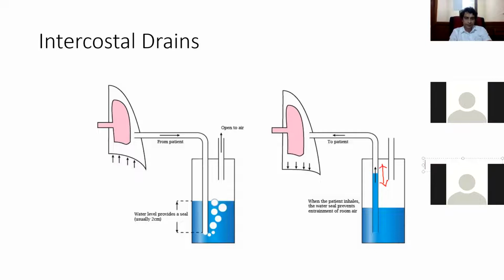That is called the swinging of the intercostal tube. So whenever you have an intercostal tube, one very important thing to check to see whether the tube is functioning well is whether it's swinging. If the tube is not swinging, that's a problem. That means that somewhere inside, maybe here, or somewhere like that, there's a block. Something has accumulated here. Maybe it's pus, maybe it's a clot of blood, maybe it's a bit of tumor or whatever, and the tube is not doing its job. And if the tube is not doing its job, that means that over here, fluid or whatever is now accumulated. So whenever a patient has an intercostal tube, you must check whether there's a swing.